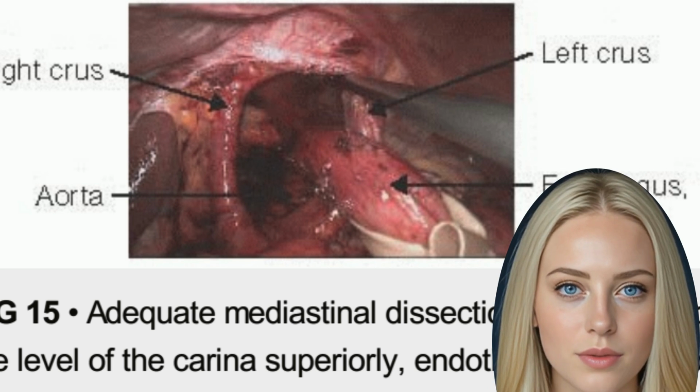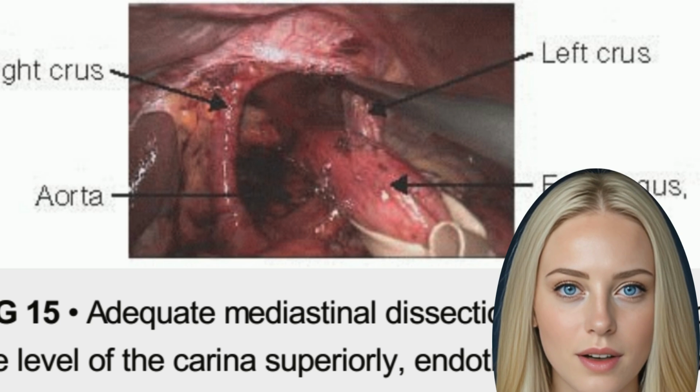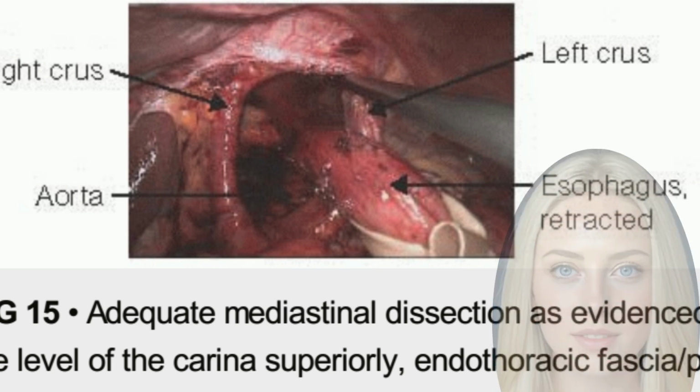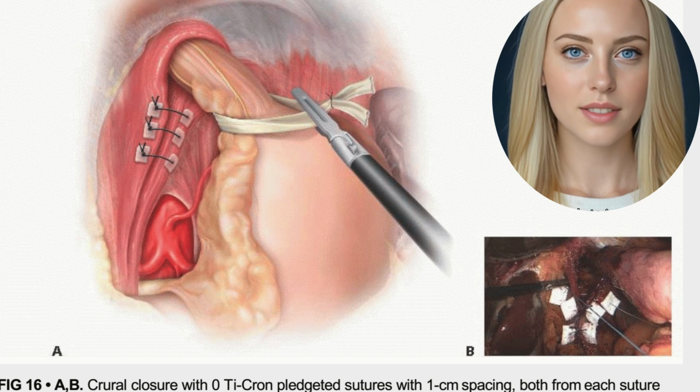Before complete 360-degree dissection can take place, the short gastric vessels must be completely dissected, even if a previous procedure supposedly took place, as some surgeons selectively or incompletely perform short gastric takedown, Fig 10a-c. This should be performed on the slow setting of the ultrasonic shears, as premature ligation might allow incompletely ligated vessels to retract into the gastrosplenic ligament uncontrollably.